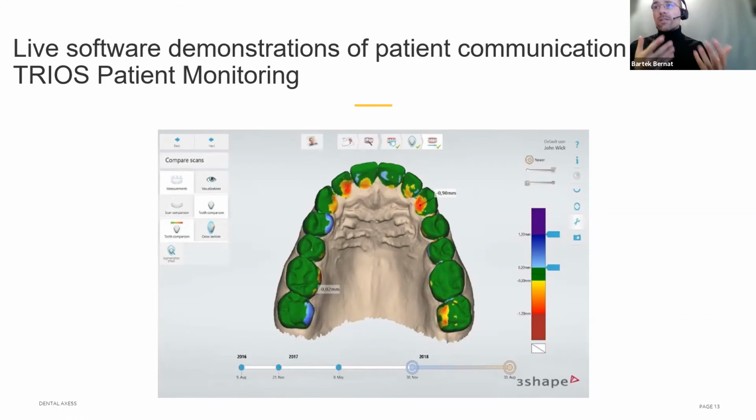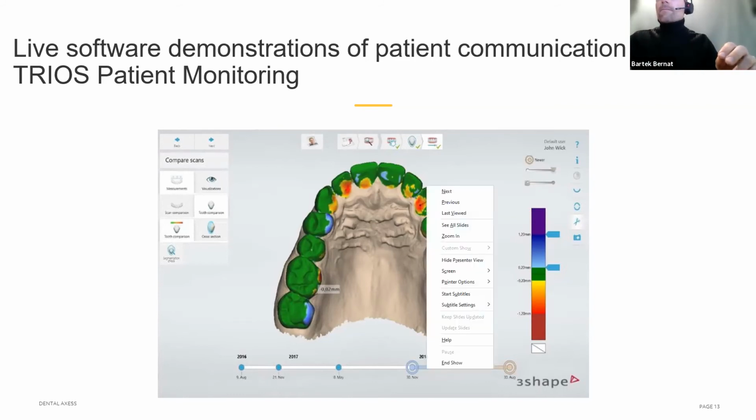For example, he or she is grinding some teeth, and this may be a problem, or there are some movements that may require some attention, and it's going to be less expensive to do it now than later. So this is a very, very powerful tool, and also a very, very powerful diagnostic tool for all of us. So yeah, let's just get to it. I'm going to show you 3 different cases now, and then you will see this live.